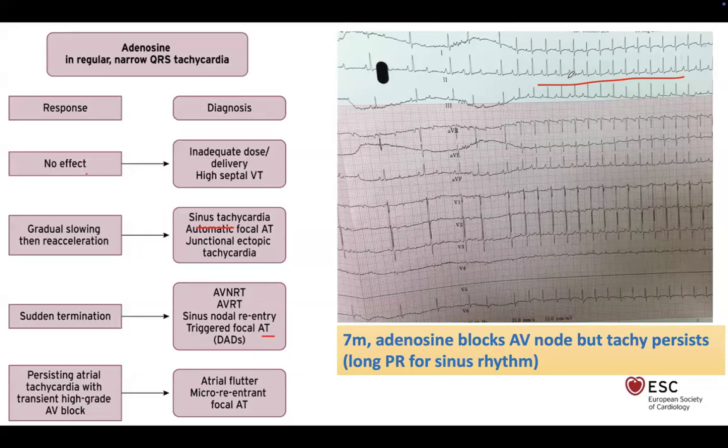If you look at the P waves, you wonder if it's just sinus tachycardia, but there's no explanation for that sinus tachycardia. Plus, the P wave looks a little bit generous, and the PR looks wide-ish for a baby who's tachycardic. You would expect when someone's tachycardic, the PR shortens. So it was a question mark: atrial tachycardia that is similar to sinus tachycardia.